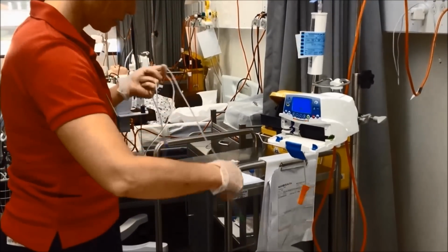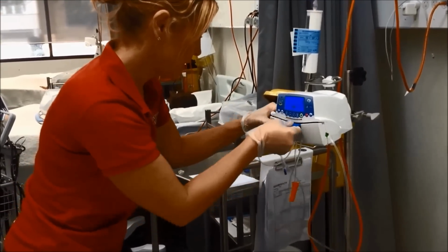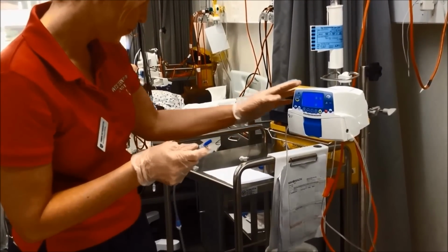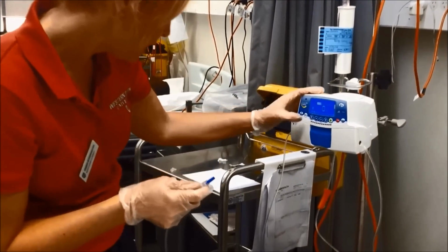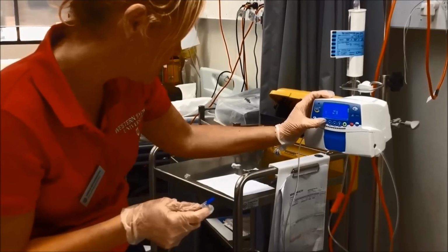Okay. Green to green, blue to blue. Beautiful. Okay, 100 mils, and 100 mils an hour, which I calculated.